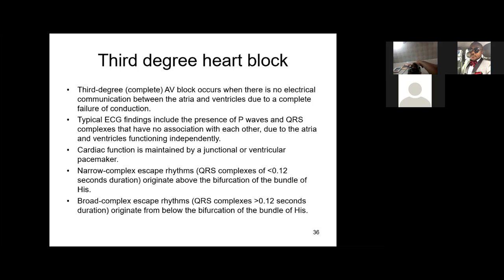There may be some narrow complex escape rhythms originating above the bifurcation of the bundle of His and broad complex below the bundle of His. In other words, ventricular depolarization is being activated all over the place. Basically, the pacemaker is no longer in the sinoatrial node per se.